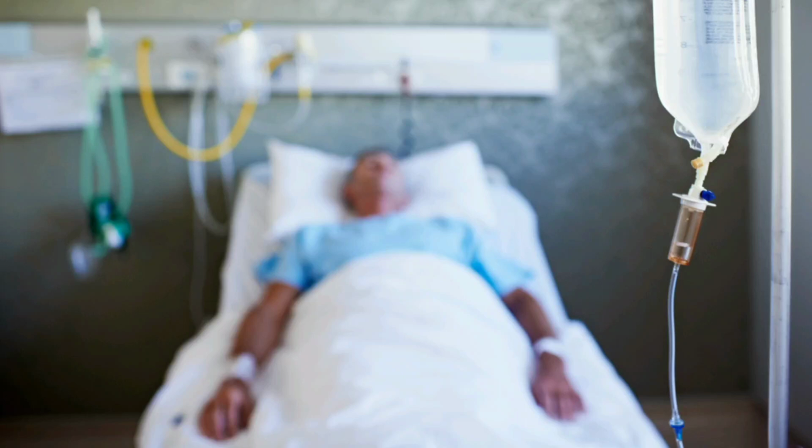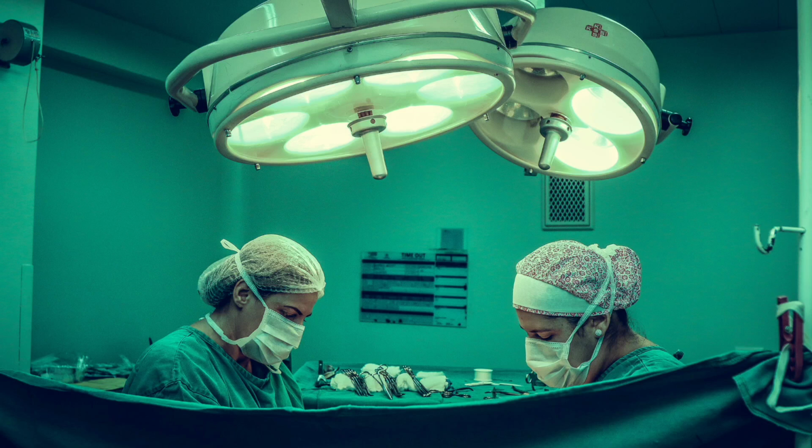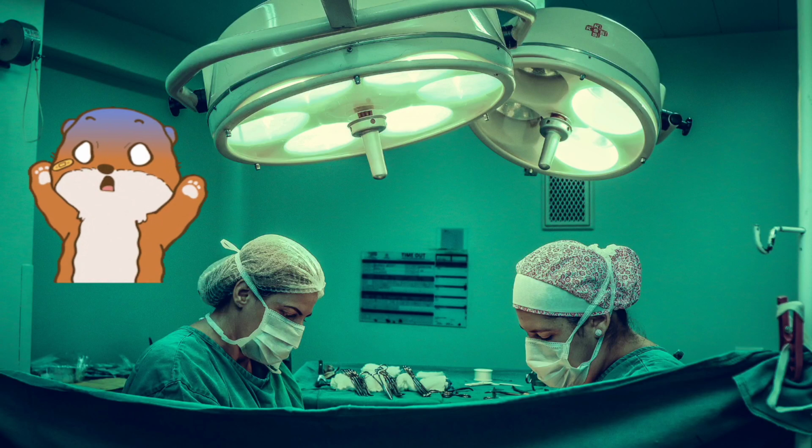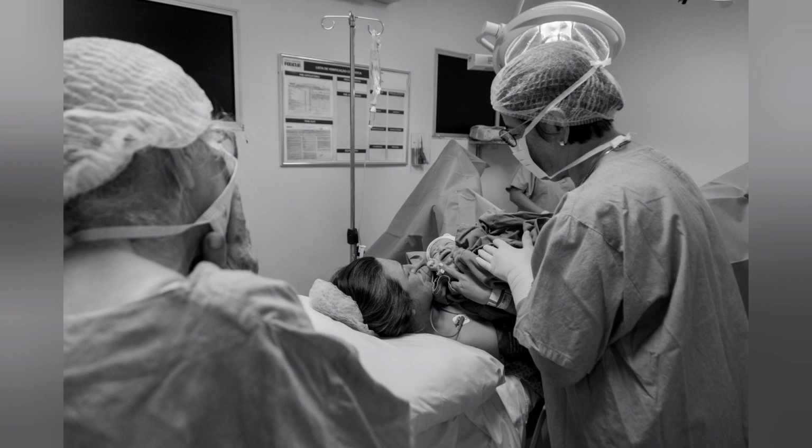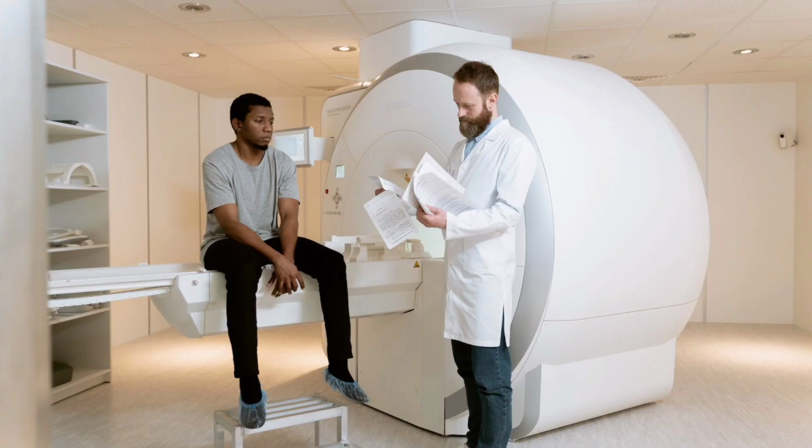The patient might be unconscious or in a coma or somehow he or she is unable to breathe due to some other conditions in the body. Still, we might need mechanical ventilation. And during surgery, usually during a major surgery, the patient is made unconscious and all the muscles in the body, including the respiratory muscles, are relaxed temporarily by an anesthetist using drugs. In this situation, he or she uses a mechanical ventilator to give oxygen to the patient. These are the few most common reasons why a patient is intubated.